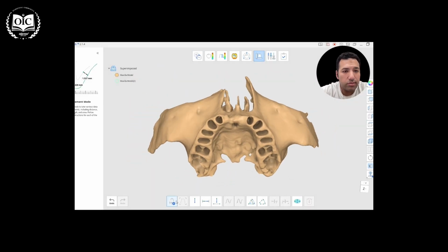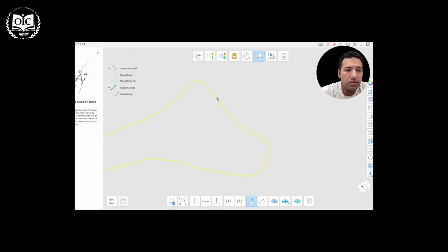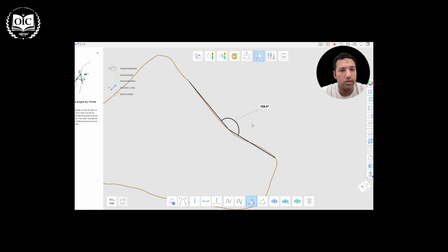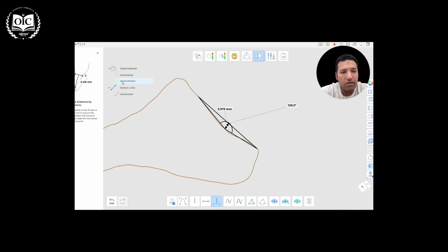Also, one last application that actually intrigued me and I found quite interesting is in the analysis of the surface topography of the bone. Sometimes we need to do bone augmentation in confined defects and in non-confined defects. So we need defect analysis. We need to see, is this defect a confined one?